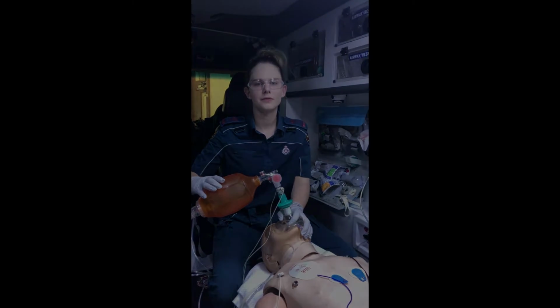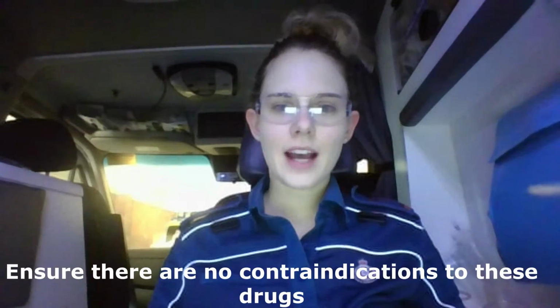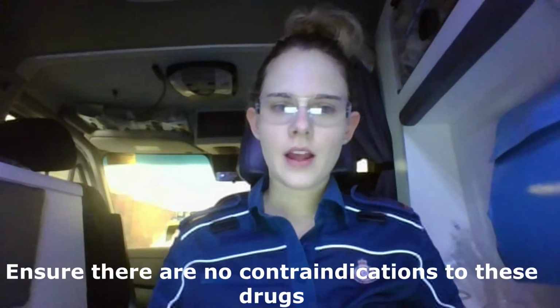Okay, we're ready for RSI. We're going to administer 105 milligrams of ketamine and 105 milligrams of succinylcholine. Plan A will include mask ventilation and tracheal intubation. I will have the first intubation attempt and use a bougie. If I'm unsuccessful, I will have a second attempt after making a change. Between attempts, we will bag valve mask ventilate the patient to ensure they return to their pre-induction state. If unsuccessful after the second attempt, we will change operators and Stuart will attempt the intubation. If he is unsuccessful, a failed intubation will be declared.